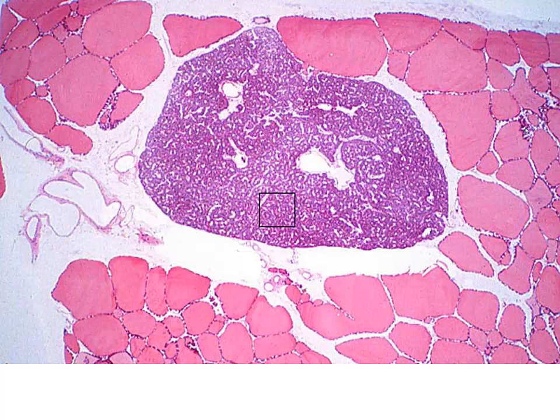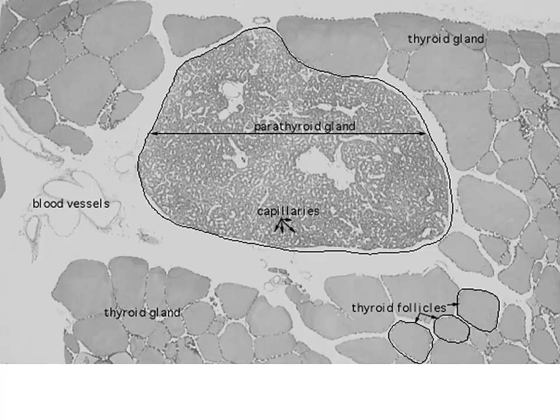glandular looking material, something we sort of lean toward a gland as soon as we see it. And so this is going to be our parathyroid gland section adjacent to the follicles. And remember, parathyroid sounds very similar to parafollicular, but they are two distinct groups of cells, two distinct positions. The parathyroid is an organ, whereas the parafollicular cells are within the thyroid organ itself. So let's make sure to keep those separate.